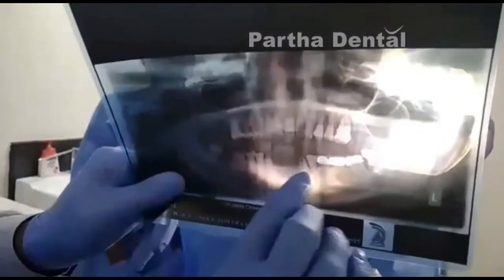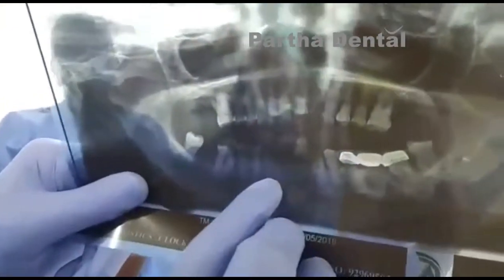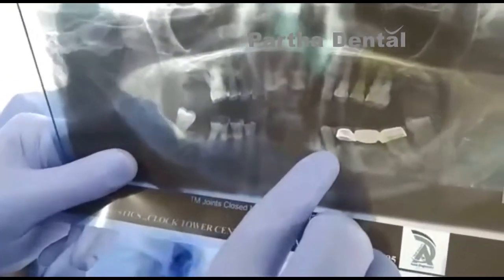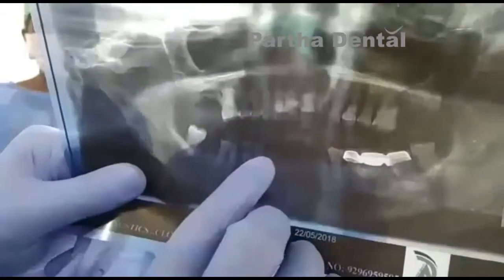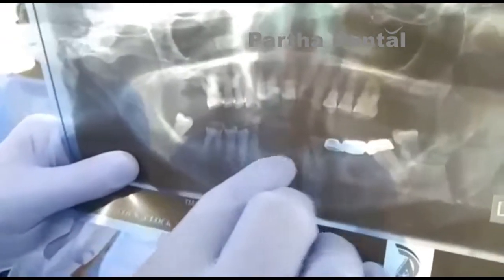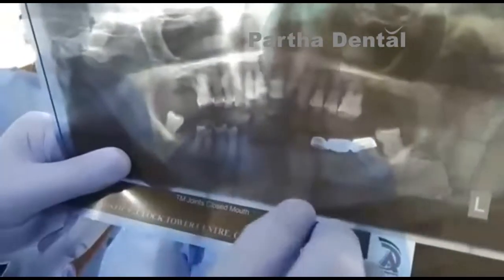So we are going to replace this piece. We are going to start with a starting line, we are going to fix the piece. So we are going to use the implantation process.